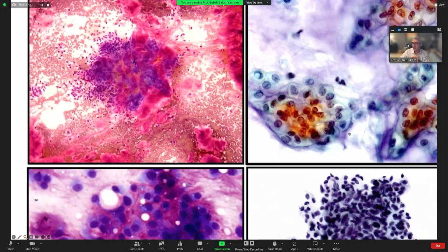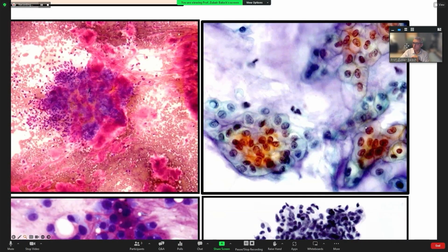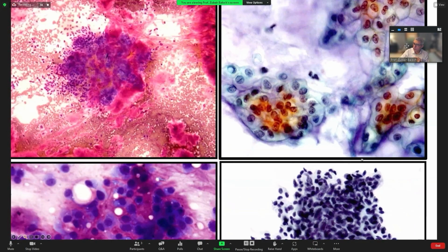Some tumors can have a lot of cartilage in them, and you can see this fried egg appearance is very typical of these cells. Plus, they have an almost lacunae type appearance. So this is really a cartilage forming tumor, plus that clear cytoplasm and really nondescript nuclei.